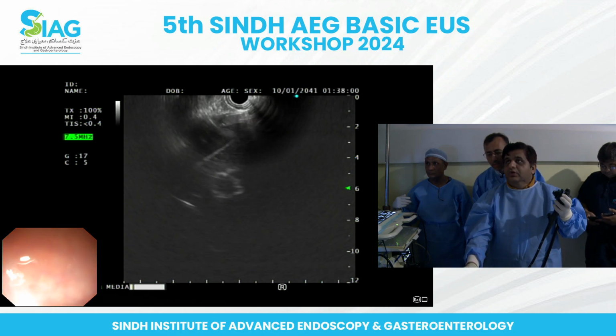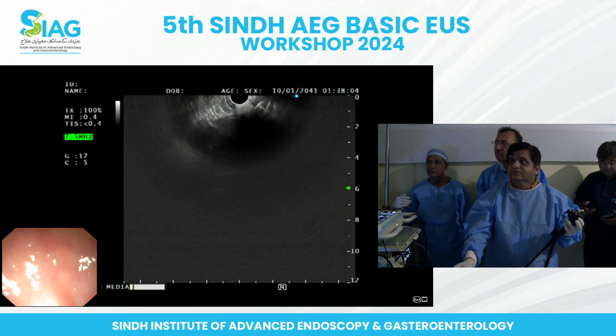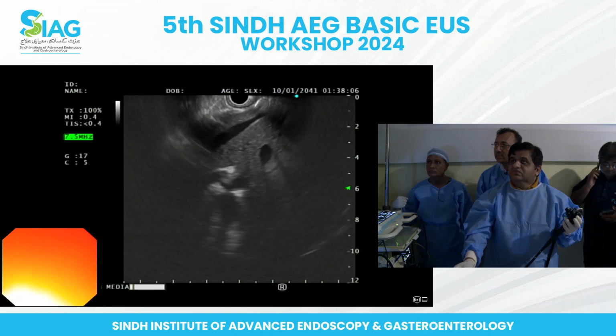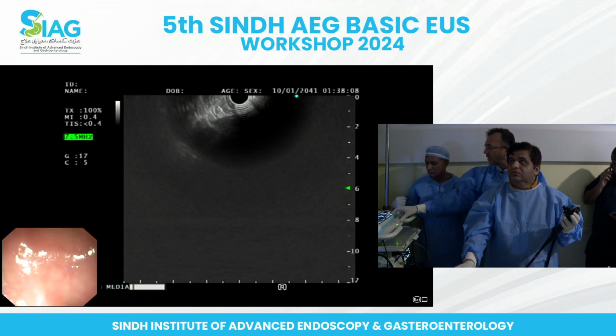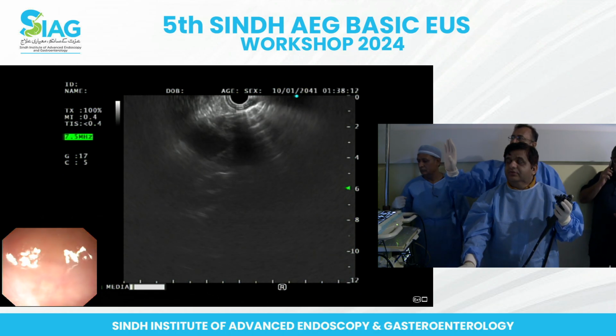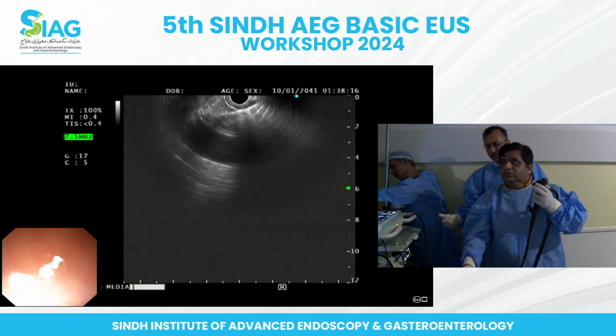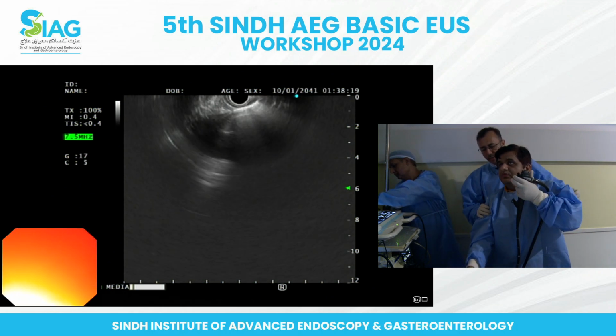Okay, what do you see? Basically, it's liver? Yes, sir. Okay, once you've seen the liver, instead of going into the details of the structures at this stage, I think let's concentrate on the mega things. You have seen the liver. Now, once you've seen the liver, rotate to the right. In other words, clockwise rotation. Rotate yourself to the right.